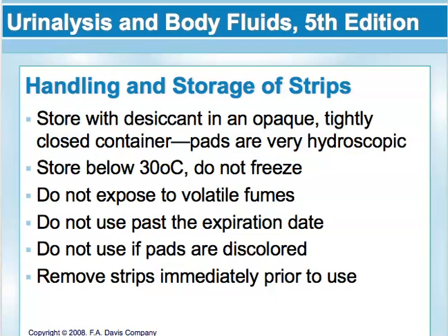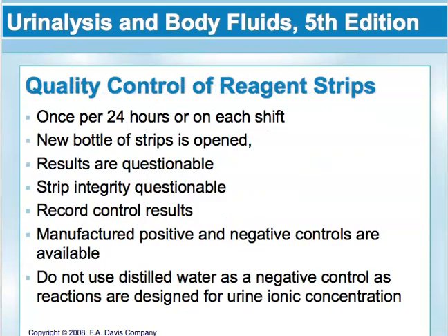And visual examination should be done to make sure that the strips do not show any kind of deterioration or discoloration in the pads, even if they are still before the expiration date. Maybe they were exposed to something inadvertently and you weren't aware of it. But if you notice that those strips do not look right, if they're discolored, even if they're within their expiration date, go ahead and get rid of them. And then you want to be careful not to touch the chemical pads.